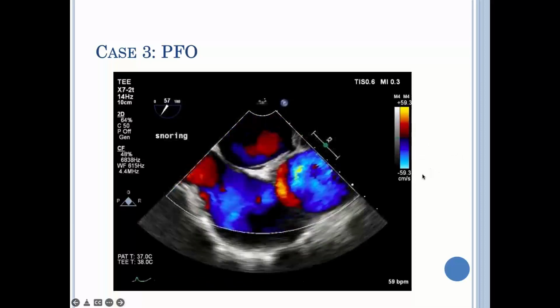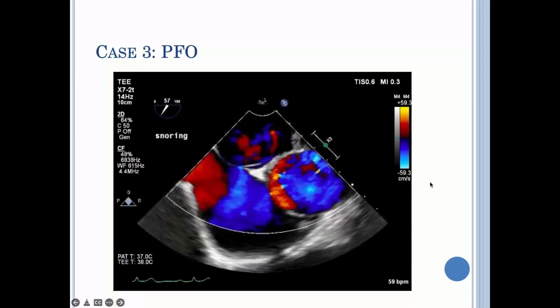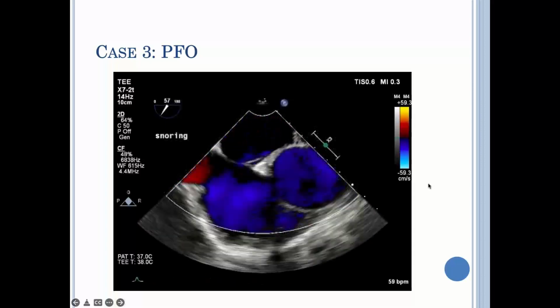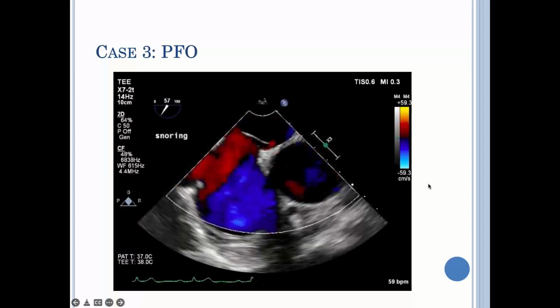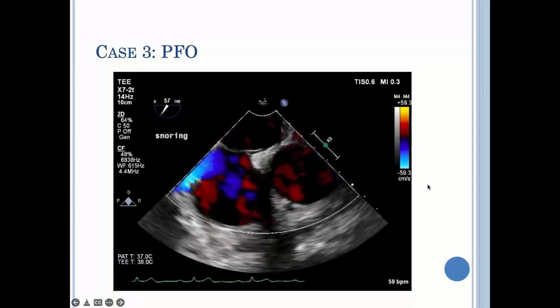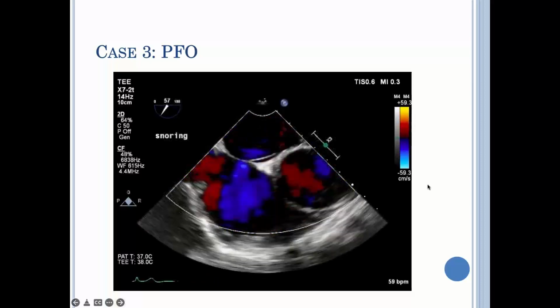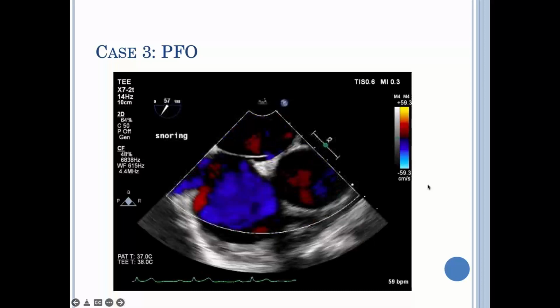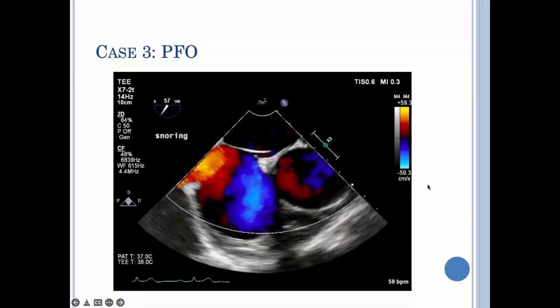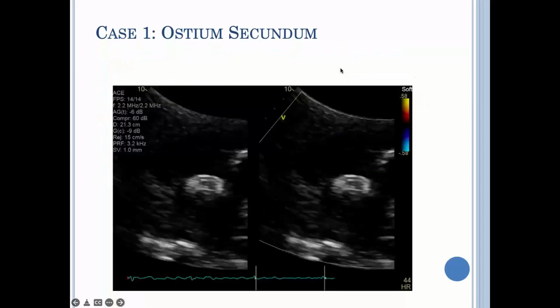Last call. Jiming, it's Bob. Hi, Bob. Hi, maybe a little discussion about the issue of the rim on transesophageal echo, and when is there not enough rim, and how many segments, as a contraindication to a percutaneous closure device? This one may be harder for Hirmand to answer. I'll let you have a go at first, and then I'll tell you what we think.